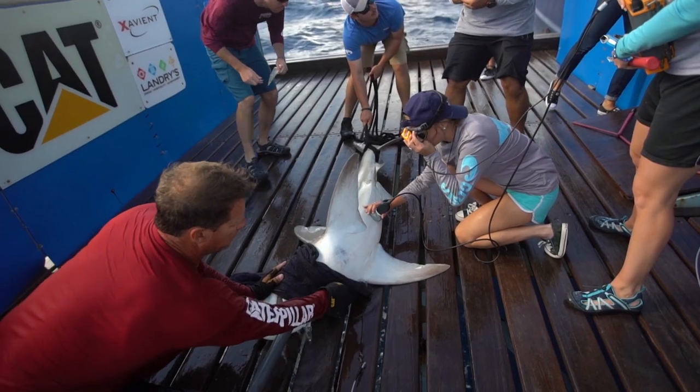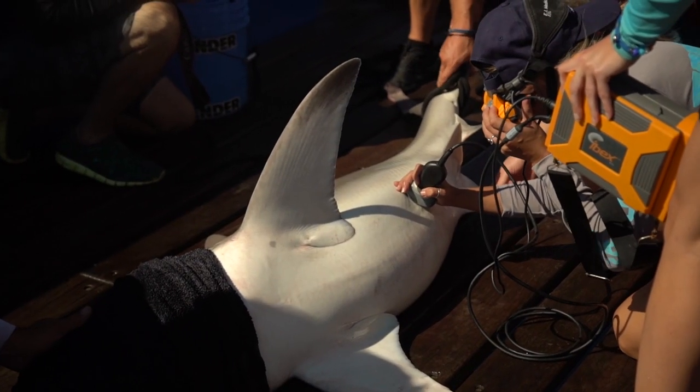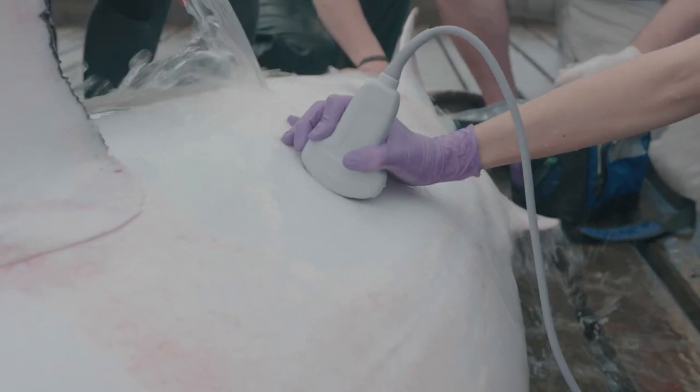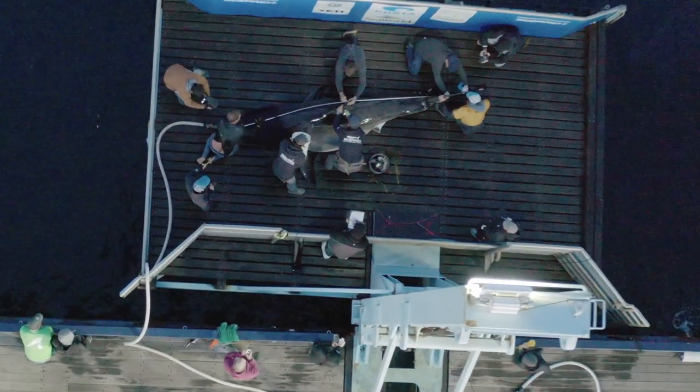When we bring the shark up onto the lift, the ventral side is exposed, and we use the ultrasound along with the ultrasound probe. We apply ultrasound transducing gel onto the probe and work from the cranial to the caudal end of the shark.